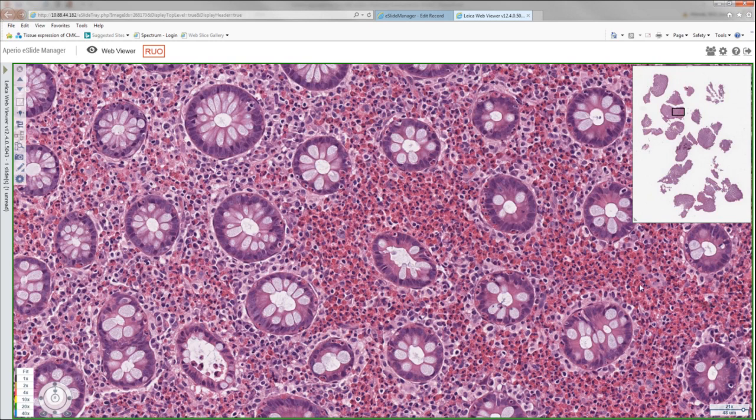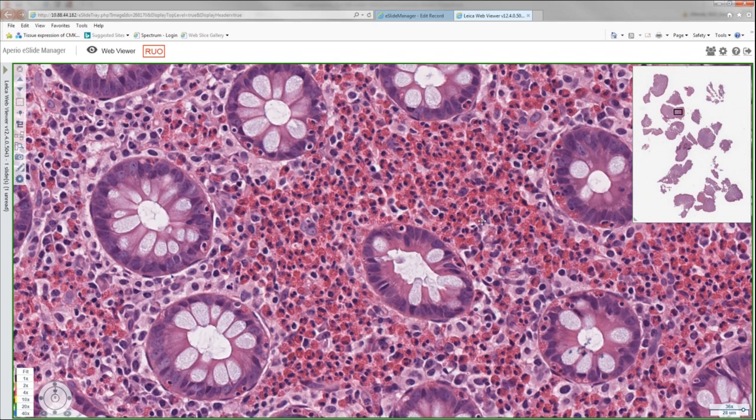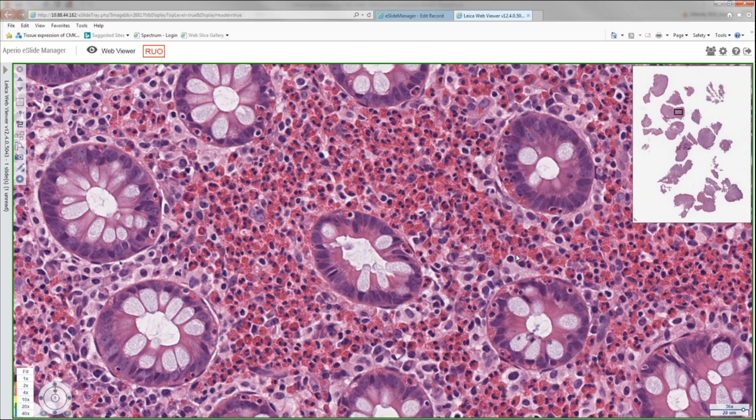Bright, granular cytoplasm. Not only that, and I would say, we said eosinophils are a normal cell component of the lamina propria, but here they are the predominant cell type. There are sheets of cells. They are attacking some of these crypts. So that is, in my mind, abnormal.